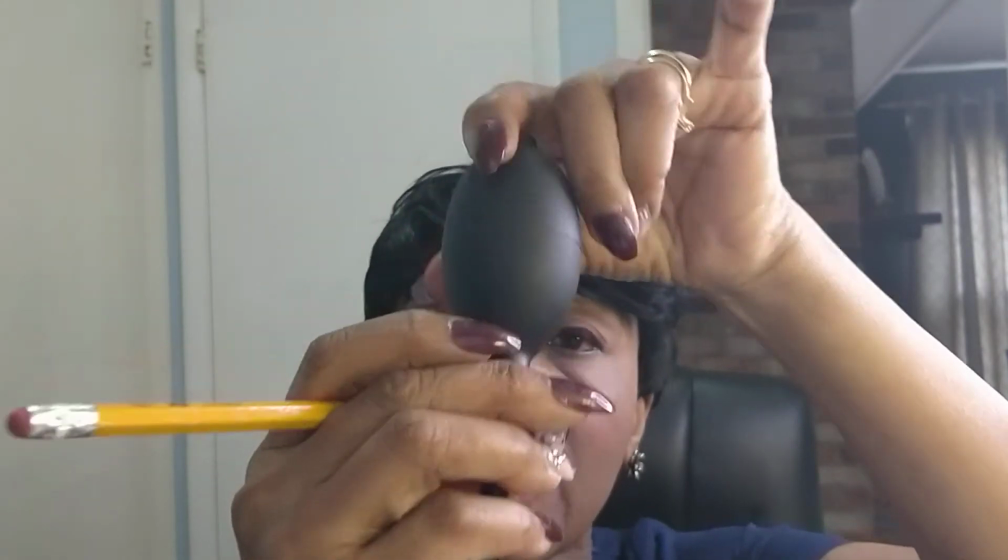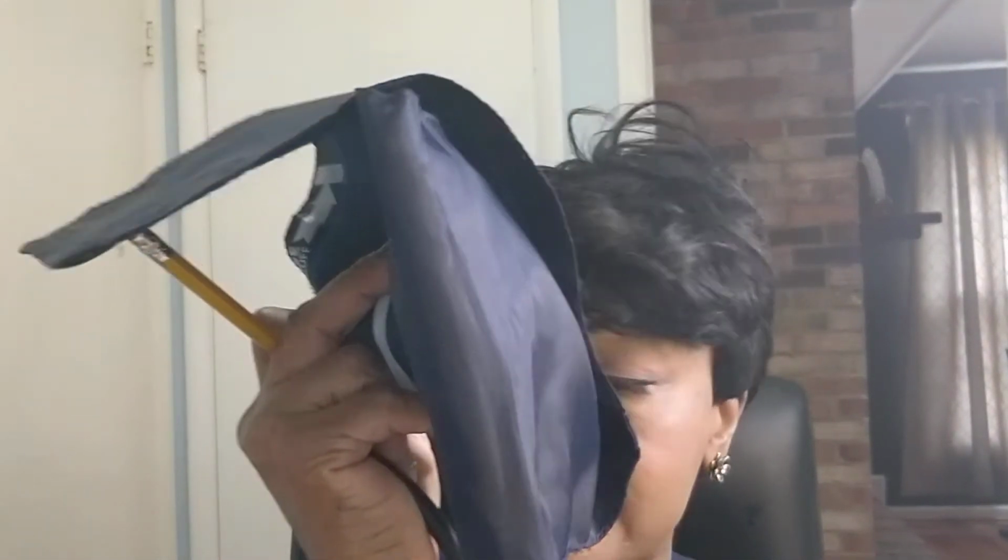This is your blood pressure cuff, and when we inflate the cuff, we have valves here that can open and close. We have to close the valves in order to inflate our blood pressure cuffs. So the blood pressure cuff is around the patient's arm, which is elevated at the level of the heart, 2.5 cm above the antecubital crease.